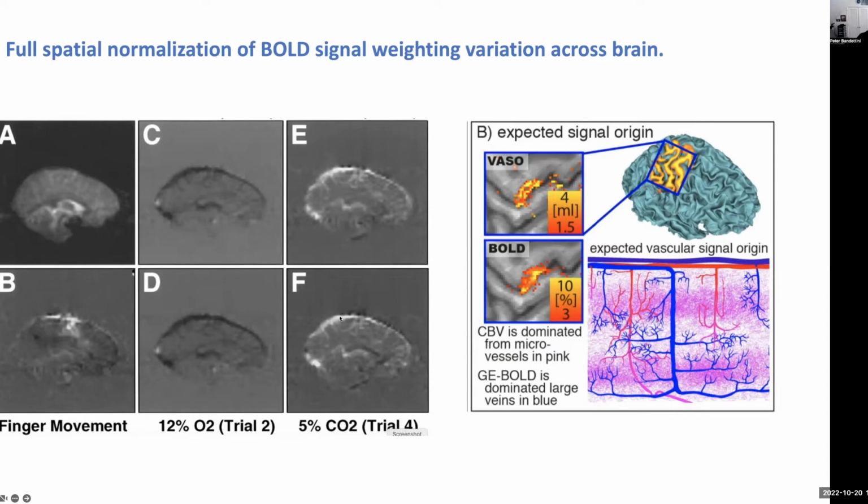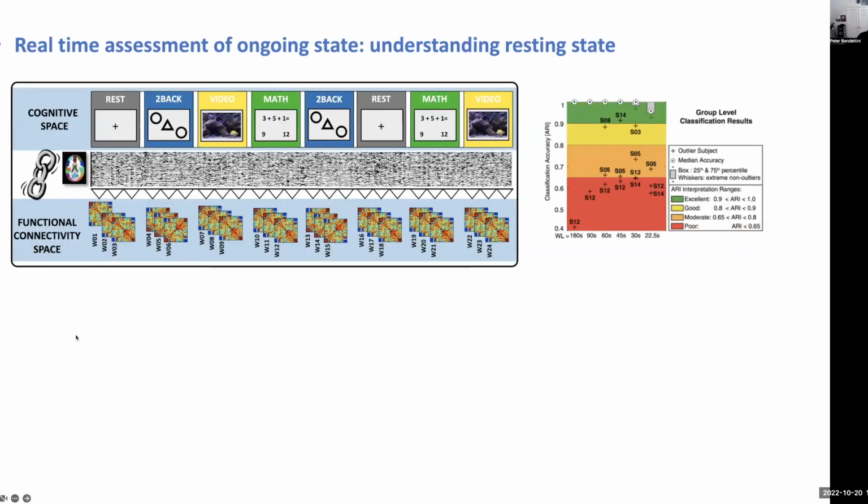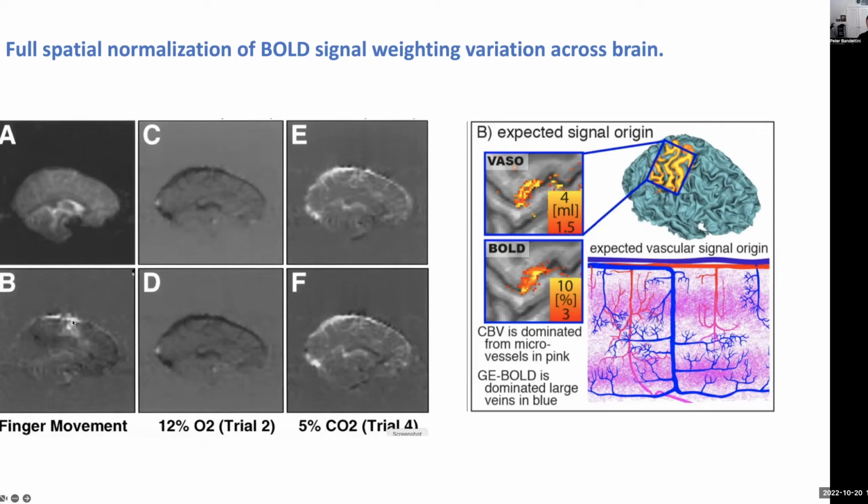So for instance, if you're trying to deeply interpret this data, and I say, oh, there's higher intensity, stronger BOLD here than maybe down here, does that mean there's more activity? No, it means that likely this is over a large vessel and this is over more of a capillary where there's only 2% blood volume. That's not a huge deal because we usually just look at general areas of activation, but it becomes much more of a big deal when we go to very high resolution.